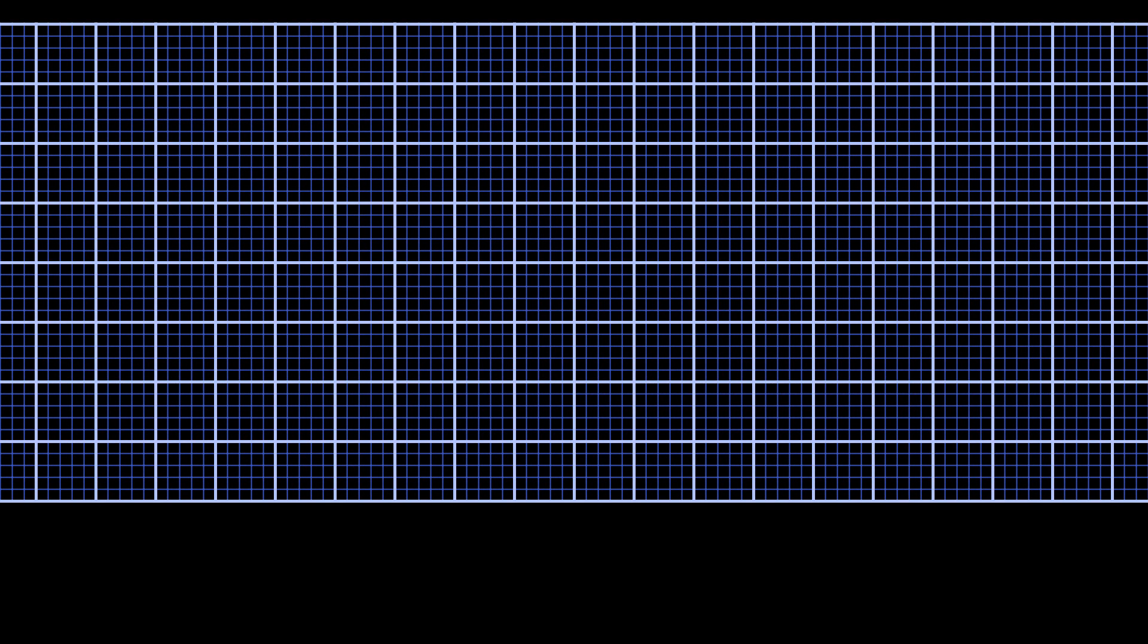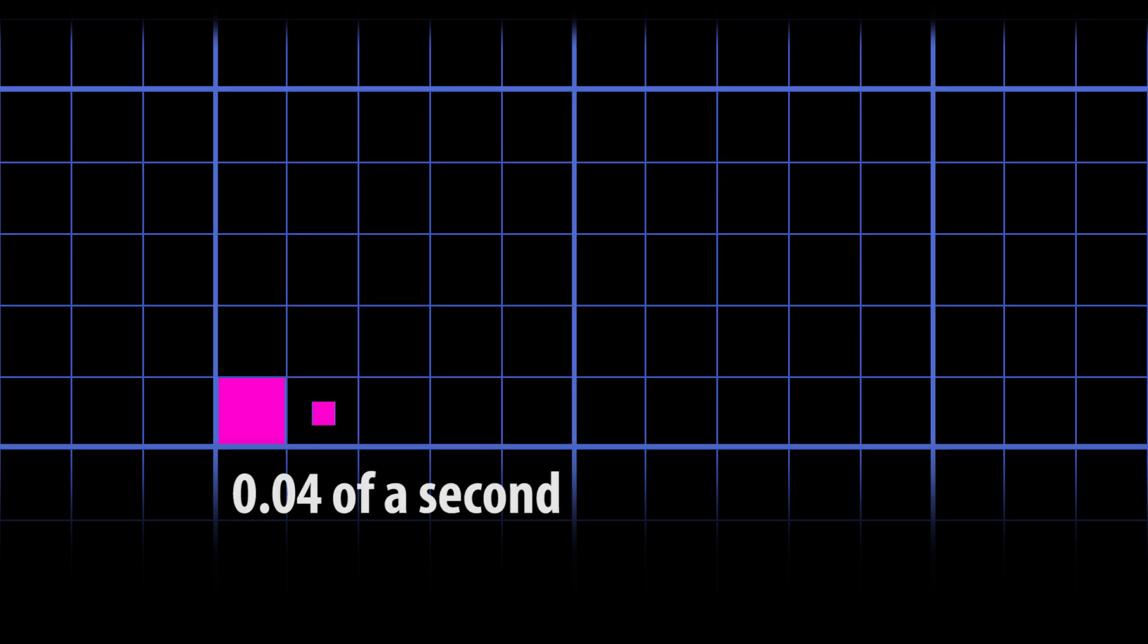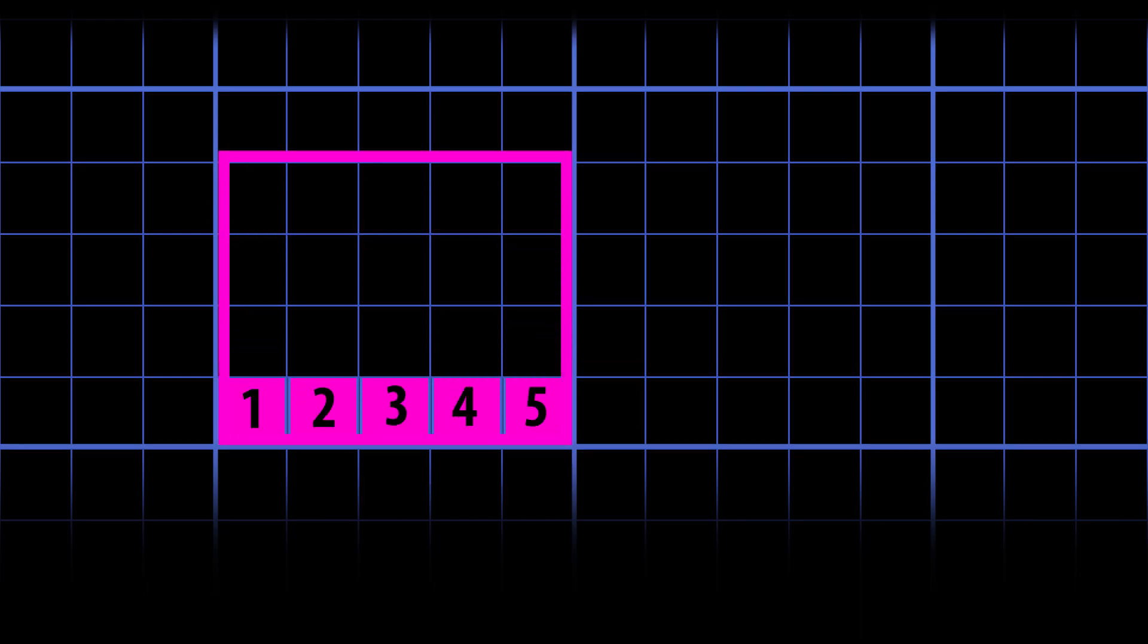So first, let's focus on how to use the graph to measure electrical impulses. The rhythm strip has smaller boxes within a larger box. Each small box represents 0.04th of a second. Five small boxes are in one large box.